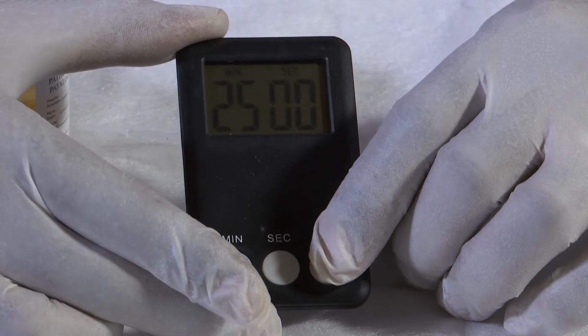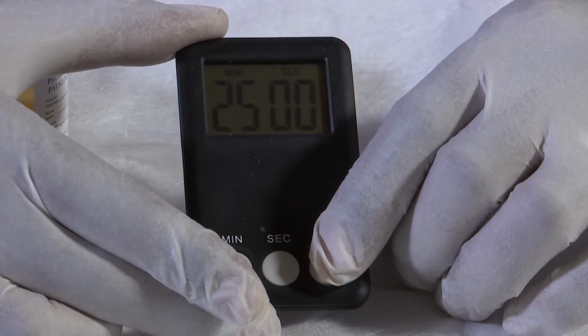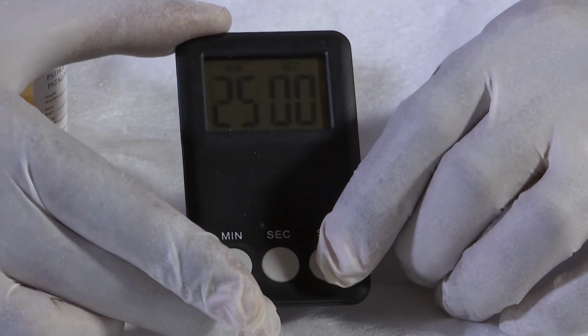Set the timer immediately after dropping the urine on the pad and wait a minimum of 25 minutes to read the result.